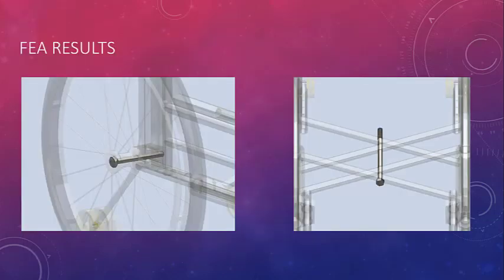Now, when it was time for finite element analysis, I decided to test the two greatest points of stress on the chair, those being the main bolt that connects the two cross supports together in the center and the quick button release pin for the wheels. I tested these two parts as if there were a 400 pound individual sitting in the chair. While my chair is most likely not wide enough for a 400 pound person to sit in it, I decided to do a worst case scenario for the best results.